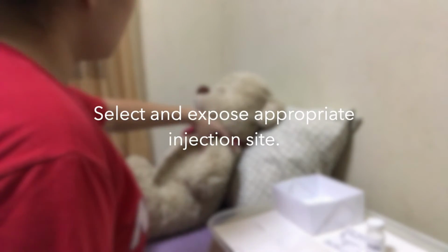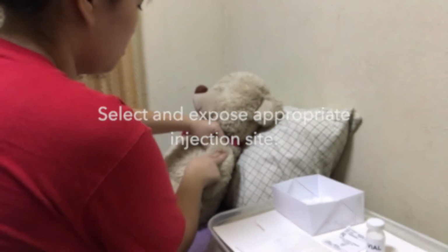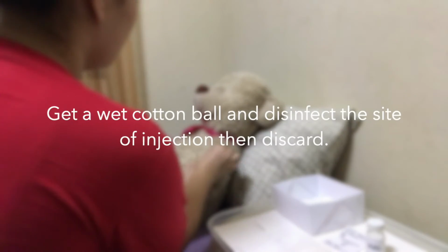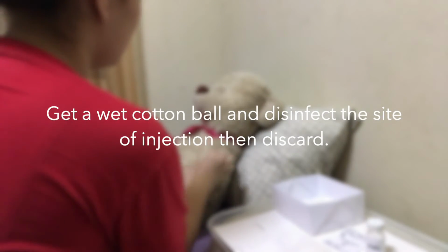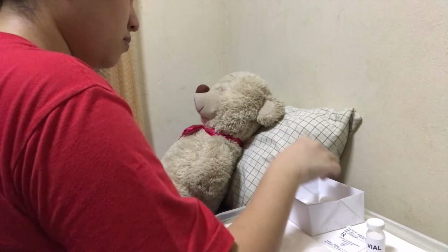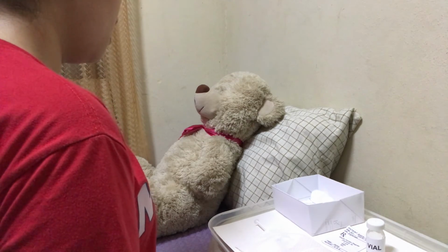Next is to select and expose the appropriate injection site. This is to prepare the site for administration of insulin. Next is to get a wet cotton ball and disinfect the site of injection, then discard. This is to disinfect the site of injection and to prevent contamination.